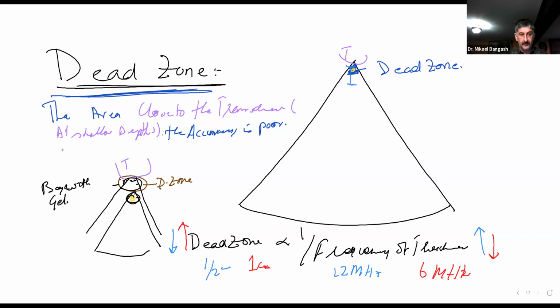Whereas if you use a low frequency transducer, you are going to have a greater dead zone. Did you guys get that? I can show it again here.